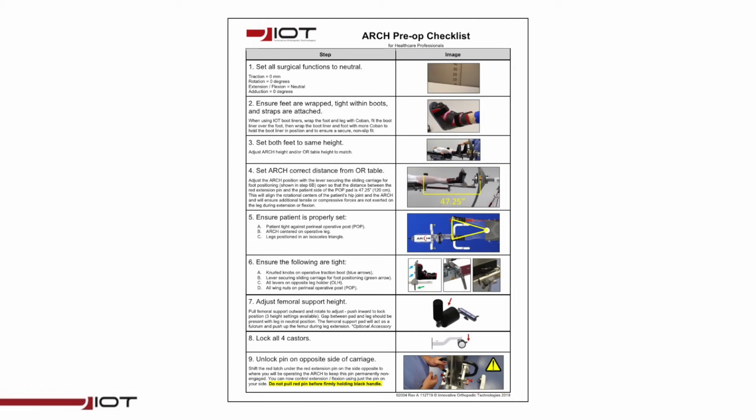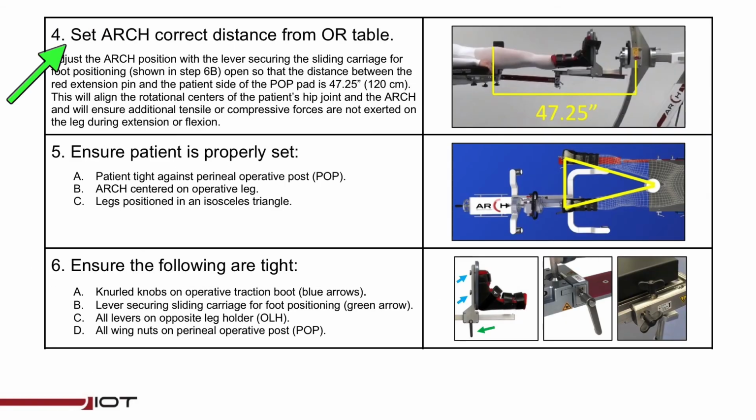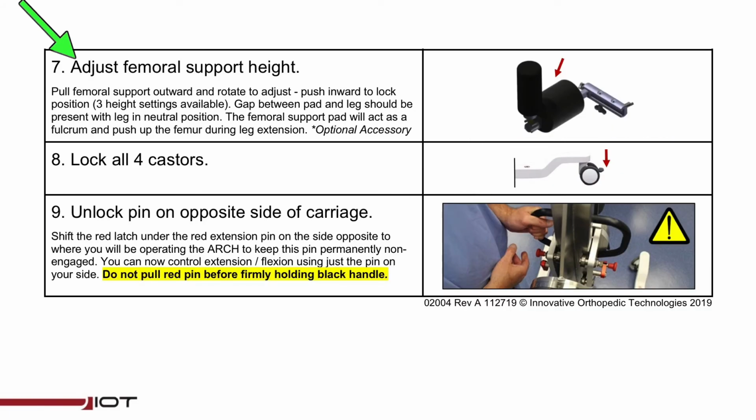Review the pre-op checklist before the case and ensure the following have been done. All surgical functions set to neutral. Feet are properly prepared. Both feet are at the same height. Arch is correct distance from OR table. Patient is properly set. All levers and knobs are tight. Femoral support set to desired height. Casters are locked. The non-operative side pin is disengaged and the operative side pin is engaged.